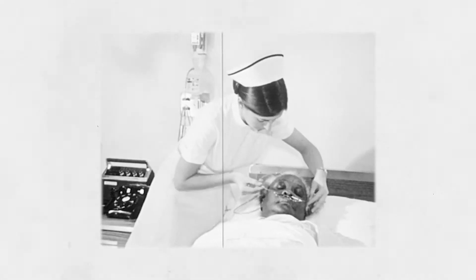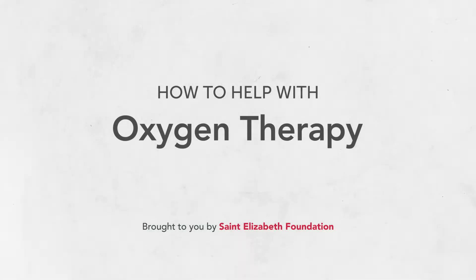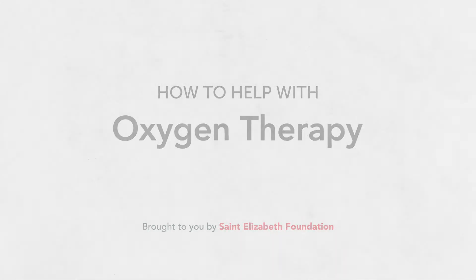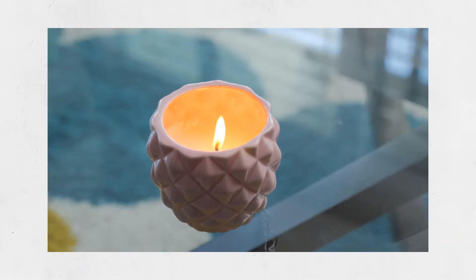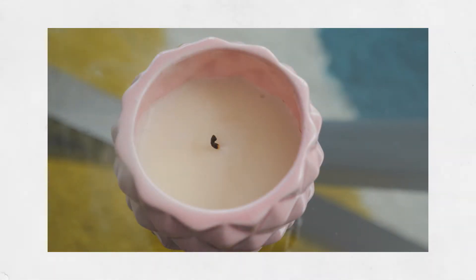If the person you're caring for needs oxygen therapy, you may need to help them with it. In this video, we'll review how to set up and take care of oxygen treatment so you can keep the person you're caring for healthy and comfortable. Oxygen is very flammable and safety is important.